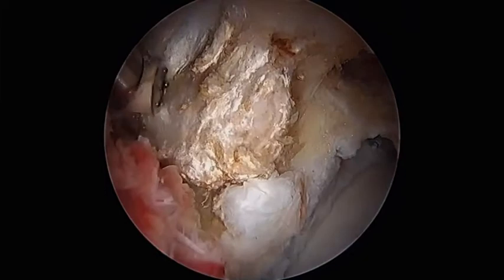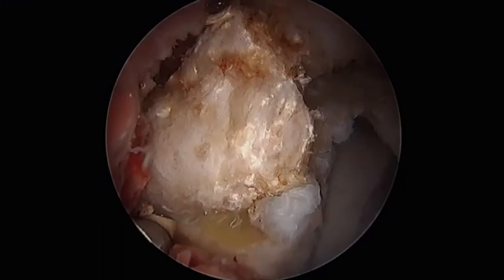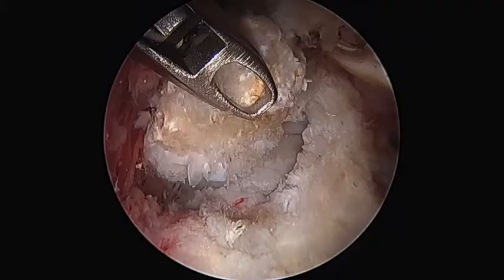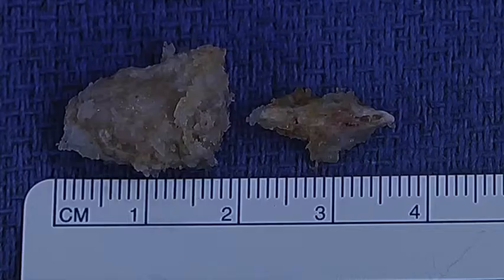If the fragment is too large, a burr can be used to divide the fragment into smaller pieces, and a grasper or cocker can be used to remove the individual pieces. The HO bone can be vascular, so if using a burr and fragmenting pieces, be prepared with the radiofrequency ablation device to cauterize as needed.